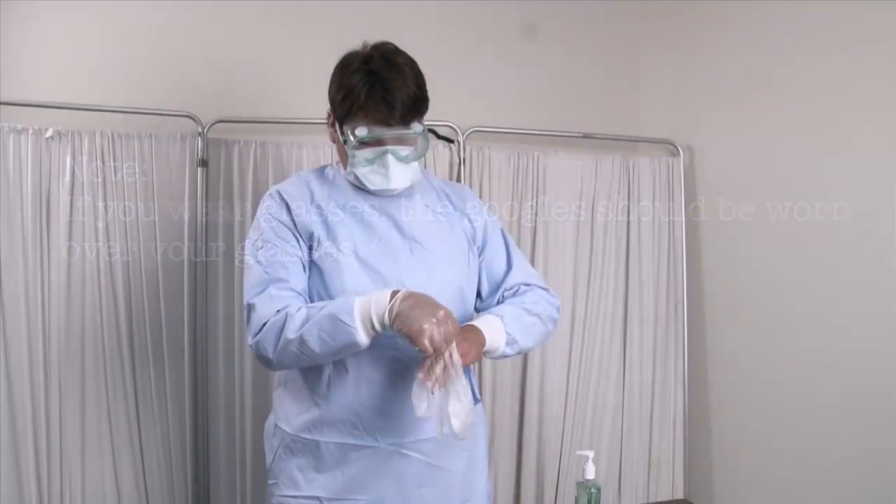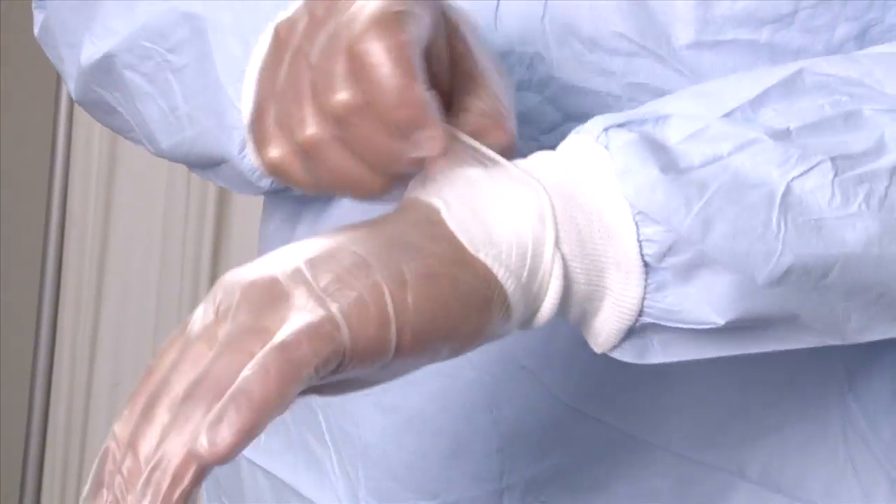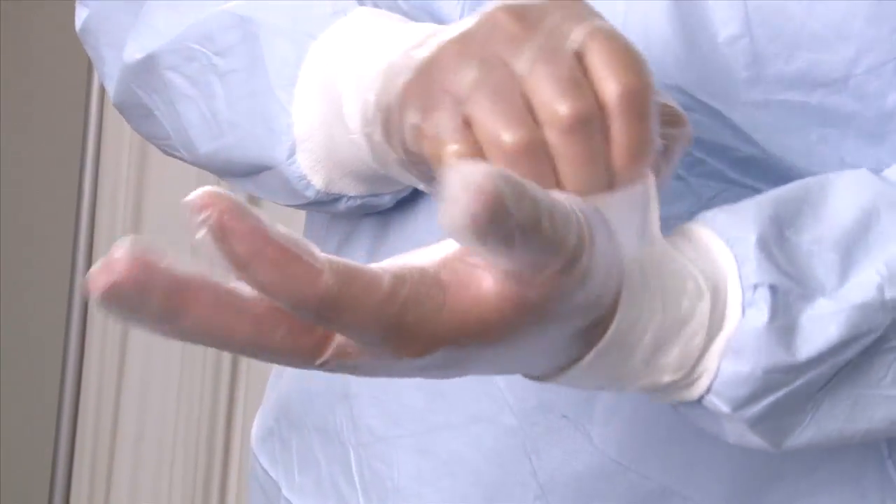Note: If you wear glasses, the goggles should be worn over your glasses. Step 5: Put gloves on, ensuring that the cuffs of the glove cover the wrists and go over the gown.